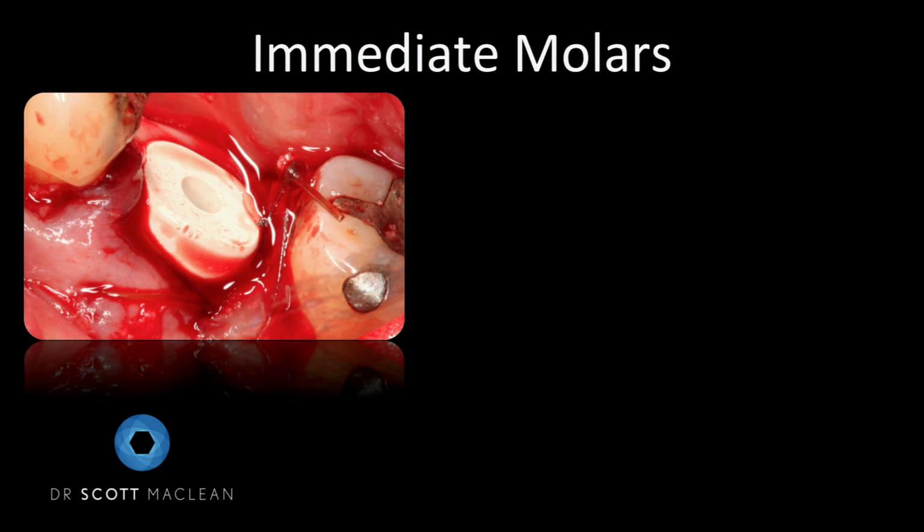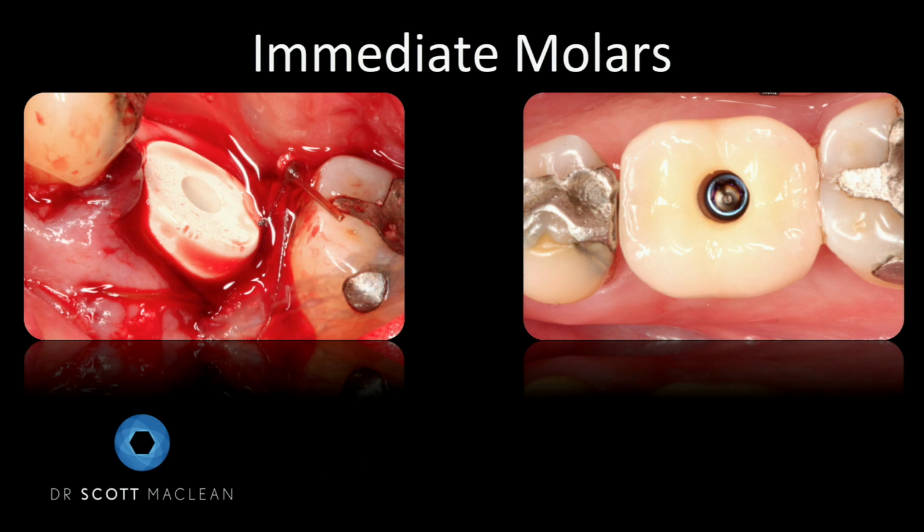If I take the case to final, we can see that once the PEEK abutment is put in place, this is going to allow the healing to be made to have the proper emergence profile. Once the patient comes back, in this case, they had an ASC abutment, standing for angulated screw channel. It's all idealized, so we want the screw channel to be where we want it to be. You can see the OmniGrip screw on top of this.